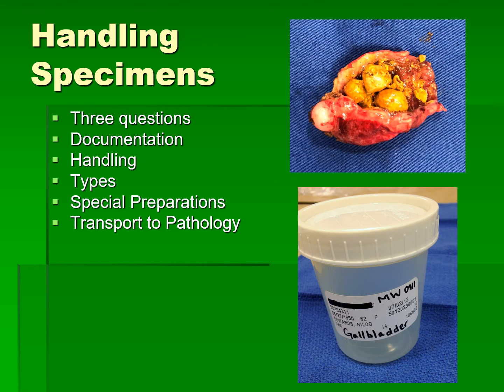Sometimes the surgeon will mark the specimen. That means they might put a stitch in a certain area of the specimen. You also want to communicate that information. Also, learn from me. If a surgeon takes out a biopsy and places it on the field, do not pick it up. Do not move it unless you specifically ask that surgeon if you can, because they might have set it down in a specific orientation so that they can put a stitch in it.